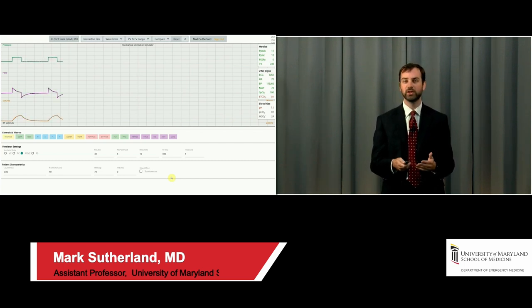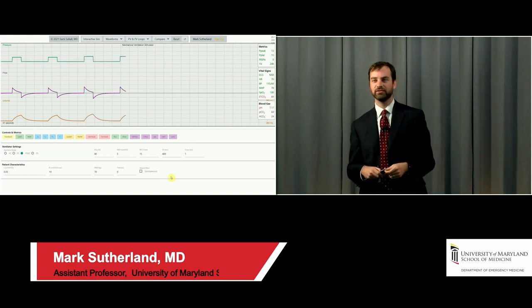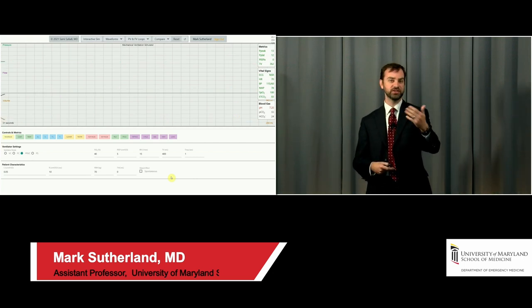But in the meantime, they went through a pretty wild swing in pH. Now, to be fair, Sammy's simulator is probably a little dramatic. I don't know if they'd go as high as 7.7 and 6.4, but maybe. And so we'll end up in a reasonable place, but the patient kind of got agitated. They maybe got sedated. They tired out. And they had a pretty wild swing in pH and PCO2. And then the real problem with this, of course, is this cycle repeats.